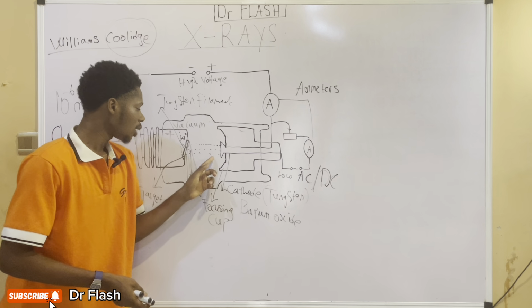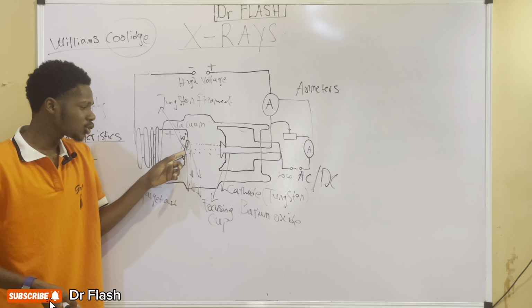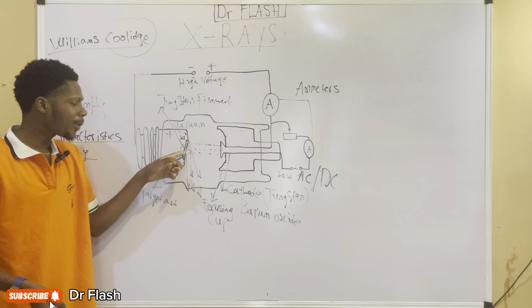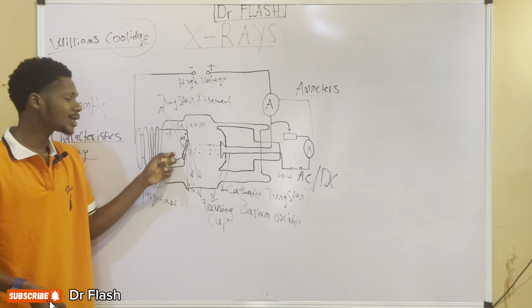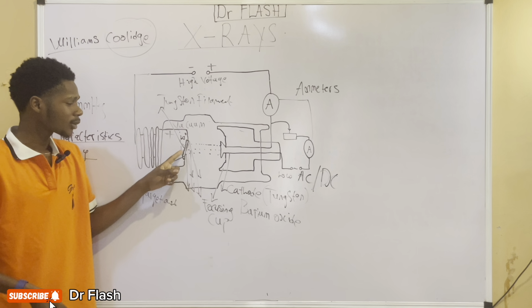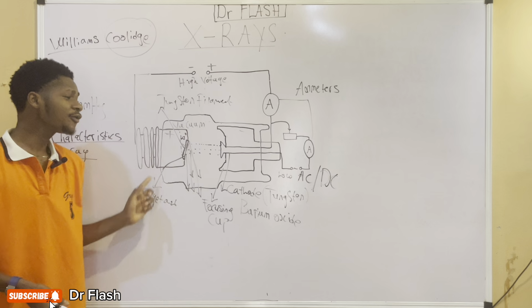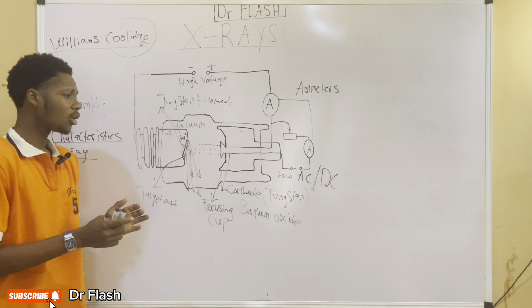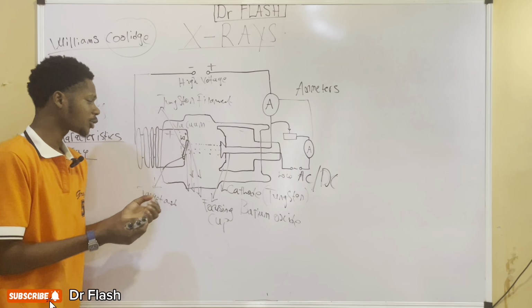So the electrons, once they pass through the orbit where you're having the electrons, these are the incident electrons. When they pass through the orbit on this anode, they approach the nucleus, and even when they get to the nucleus, some of them manage to pass it, although some of them are stopped. The majority of the time they are stopped by the attractive force.